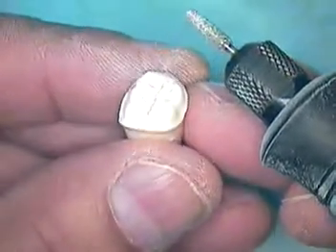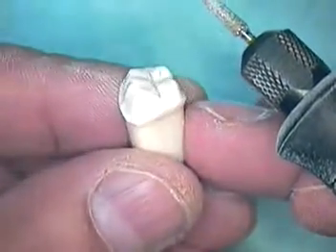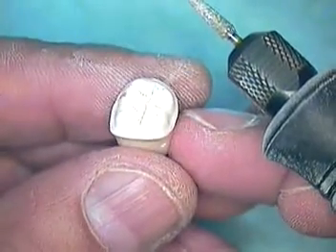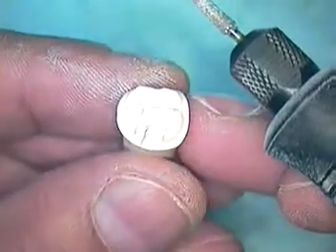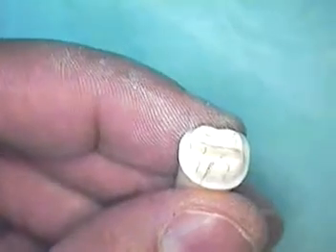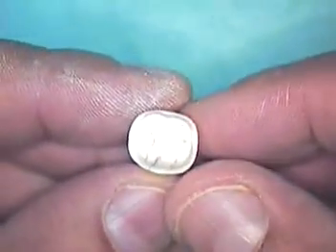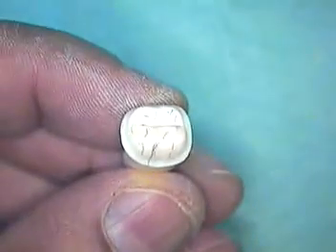This is the final look of the crown preparation. If you have any questions, feel free to contact me. This is Dr. Jerry Cuomo with the final look at the crown preparation on tooth number 30 for Introduction to Dentistry. Take care.